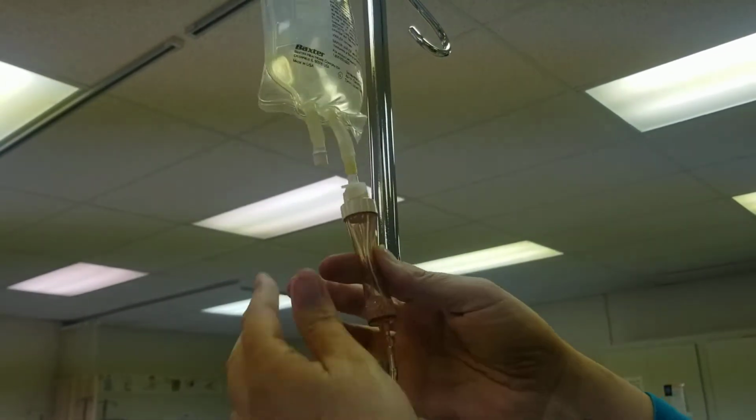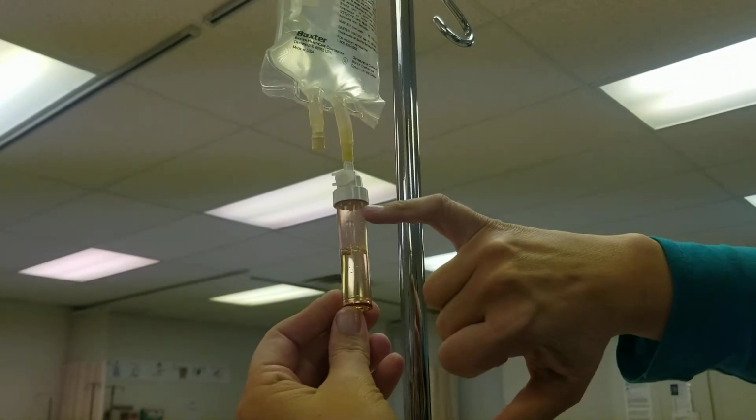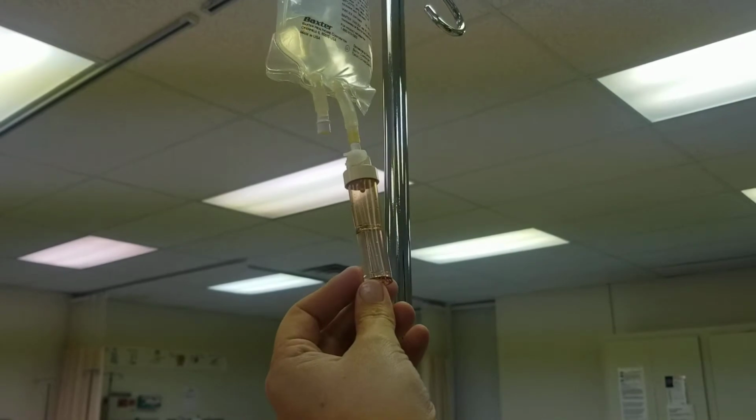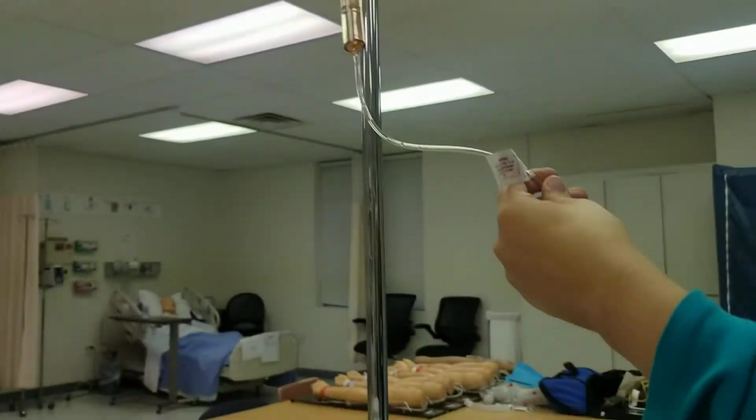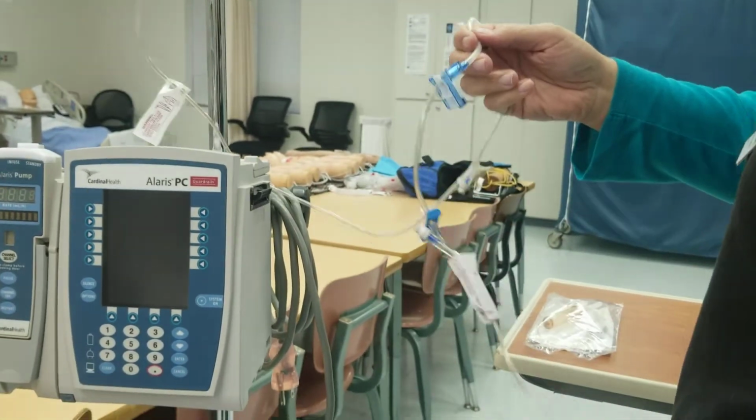And then you squeeze the drip chamber. You want to fill it up a little bit, about halfway. You want to be able to see the drops actually going into the chamber so that you know that the medication's infusing. Okay? Remember, we closed our clamp so we're not pouring out all over the floor.